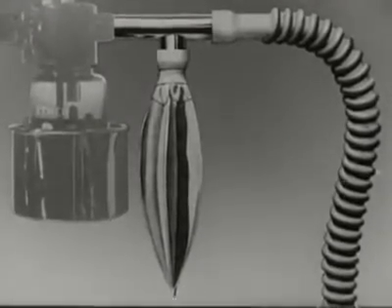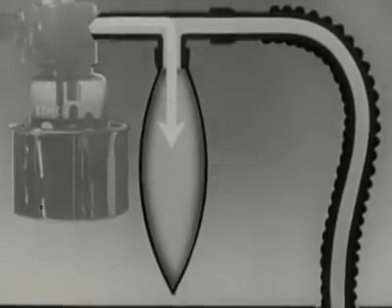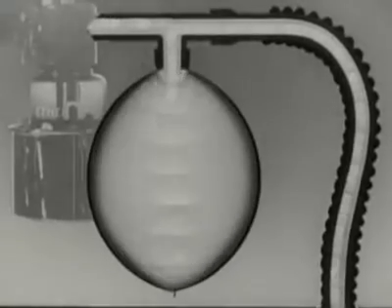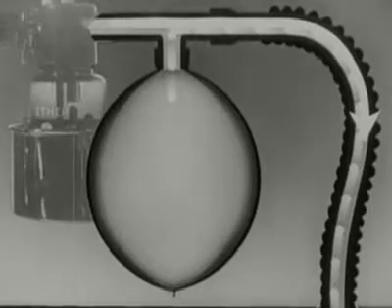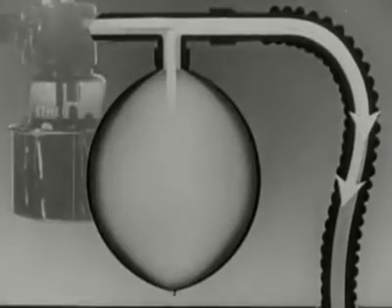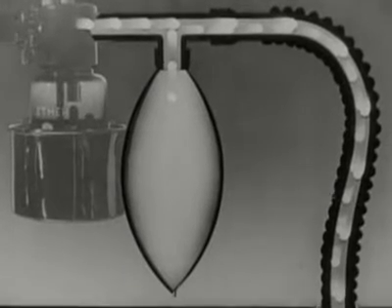To show how it works, we'll take each movement of the gases separately. The bag is filled partly by fresh gases from the machine and partly by gases from the hose blown back when the patient exhales. When it's full, the gases from the machine flow past the entrance to the bag down the hose. When the patient inhales, he draws gases from the bag in addition to the constant flow from the machine. As he exhales, the whole cycle starts again.